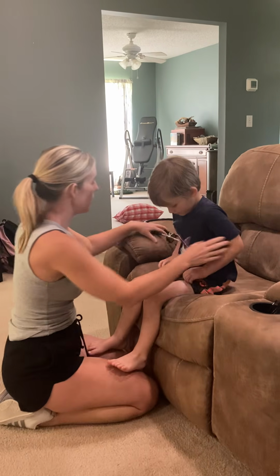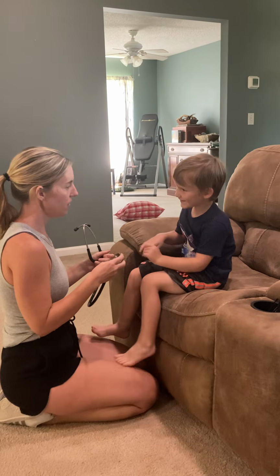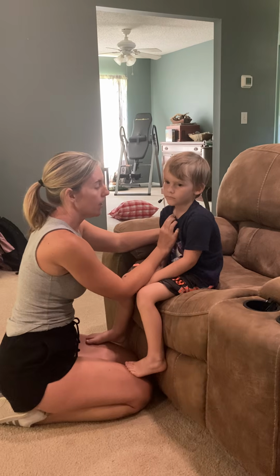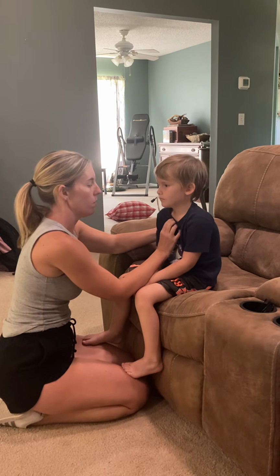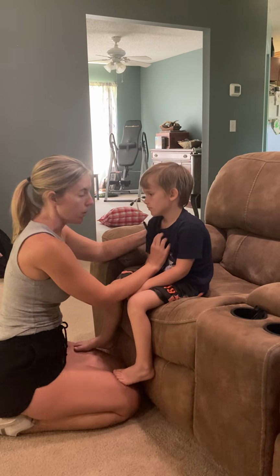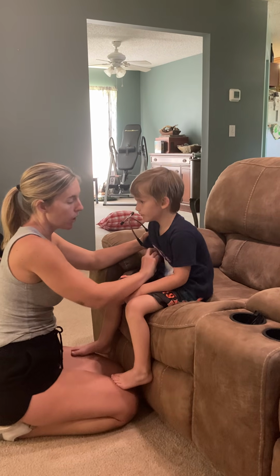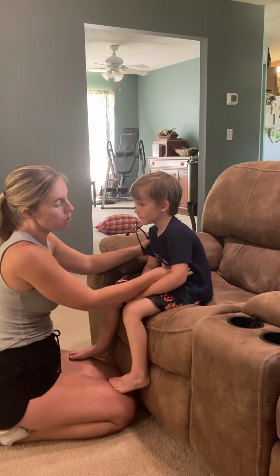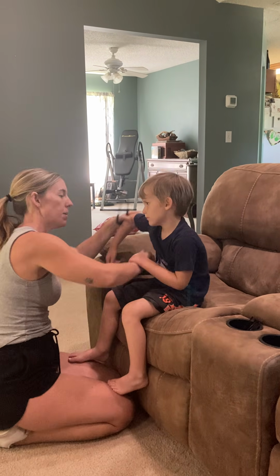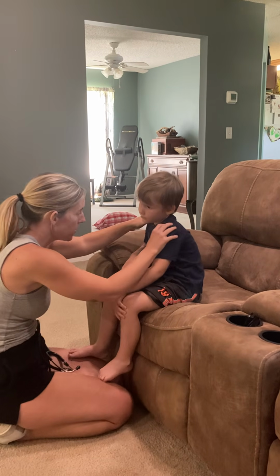So with the lungs, you're gonna be able to hit the right middle. Okay. So you're gonna start here, and you're at the right upper, or wherever you start, but you're right upper, left upper. Then you're at the left upper, right upper. And once you're in the middle, you're at the right middle, left upper, left lower, right lower, right lower, left lower. And when you come in here, it's left lower over here, but it's right middle when you do it on this side, okay? Then we're gonna come into the heart sounds.